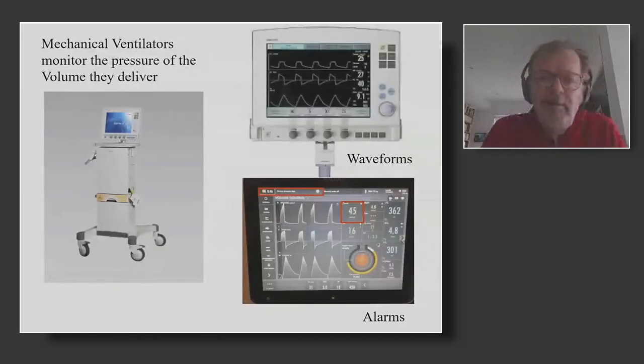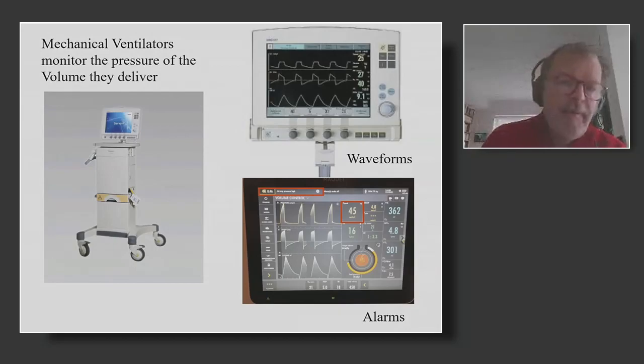So pressure on the ventilator is an essential monitoring tool. On this slide, you have an example of one ventilator, and all the ICU ventilators now have a screen like this one, giving numbers, but also displaying waveforms. On the right part of the slide, you see an example of the 3 typical waveforms, which are the airway pressure, the flow, and the volume.